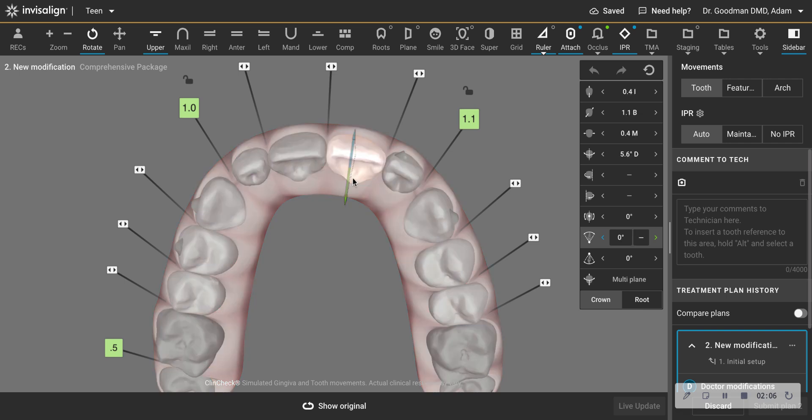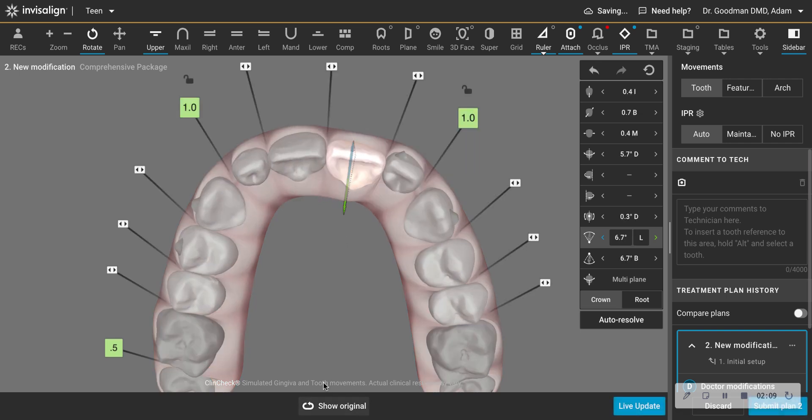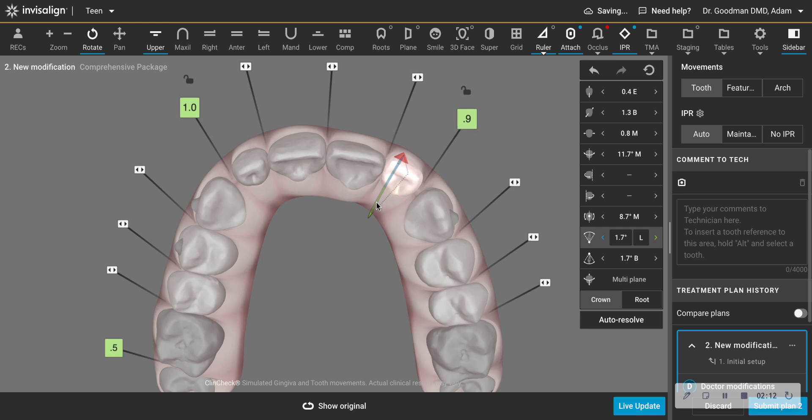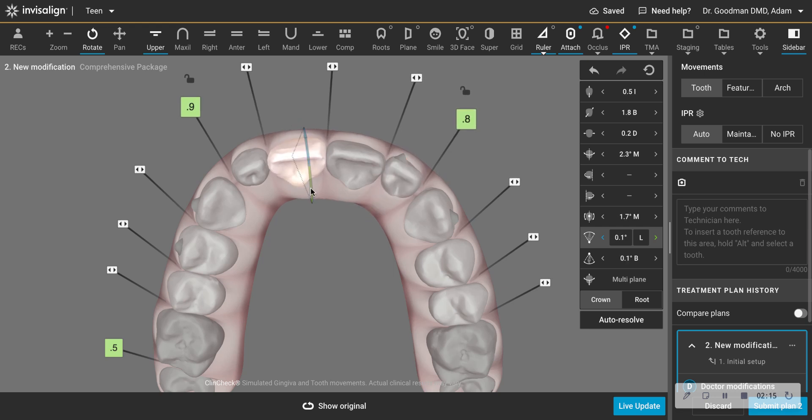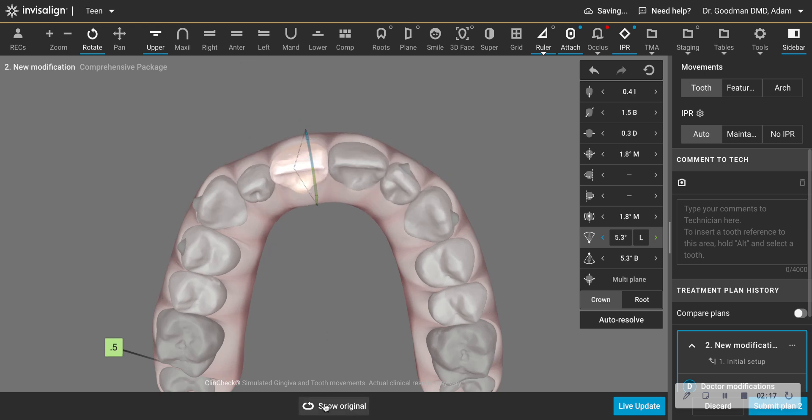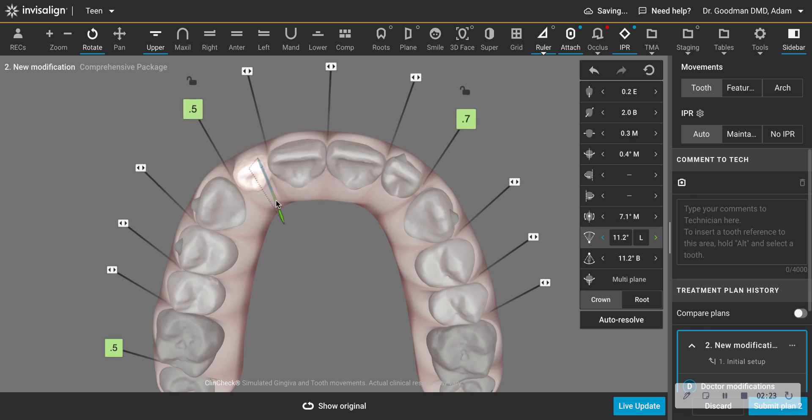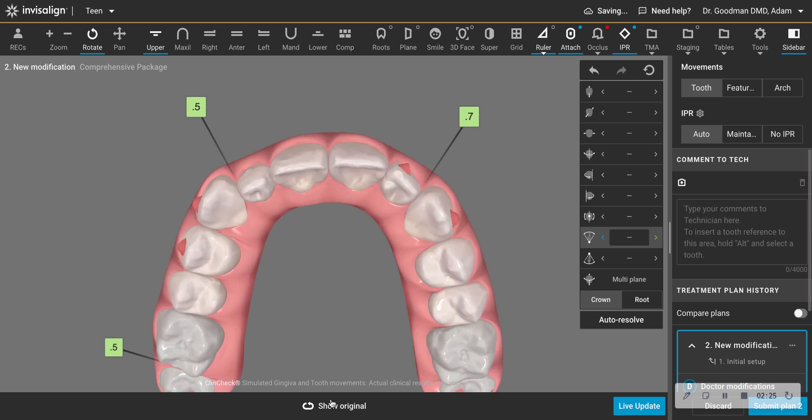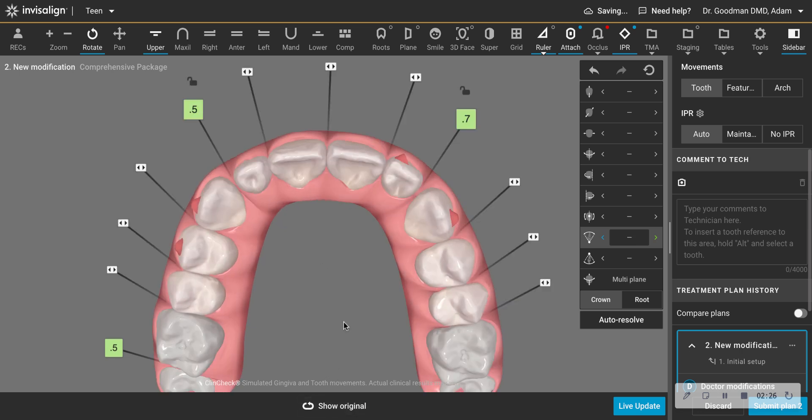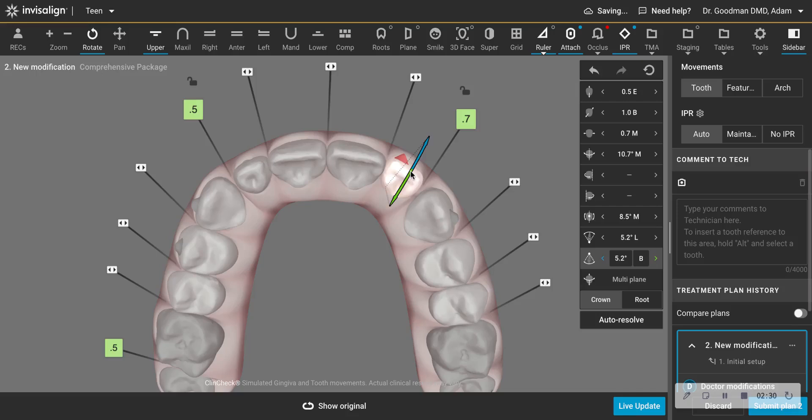So what I do is I just bring the roots back kind of towards where they were. And we're going to find out if this does give me more overjet. I just manually do this. I suppose you can instruct the technician. And then what I do, once I brought the roots back, is then I bring the crown more forward.